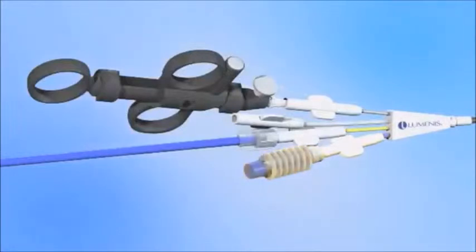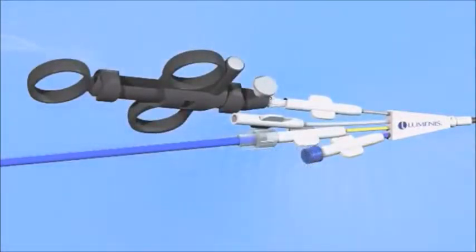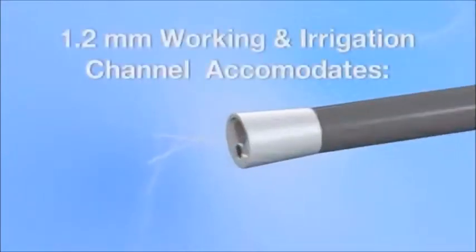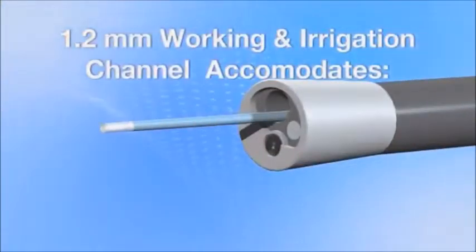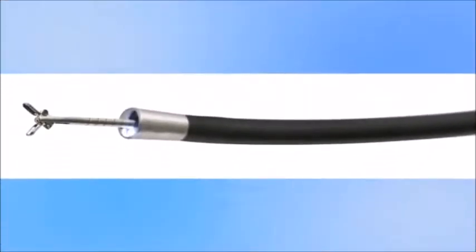The Poliscope catheter contains a channel for the fiber optic. The catheter also contains a channel with a light fiber incorporated, a working channel, and a steering channel with handle. It contains a 3.6 French working and irrigation channel to accommodate laser fibers, stone baskets, and biopsy devices.